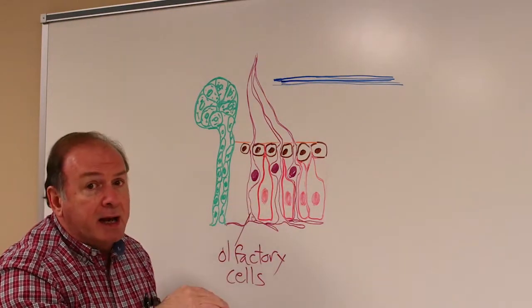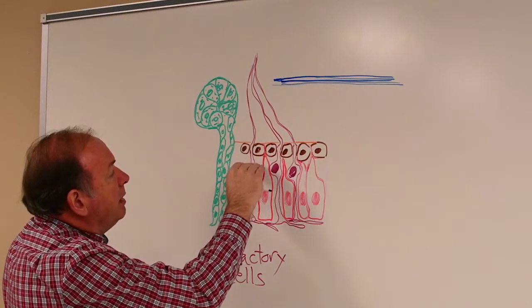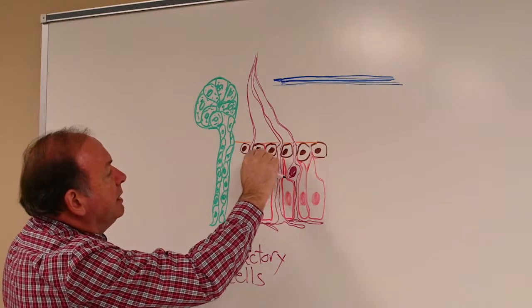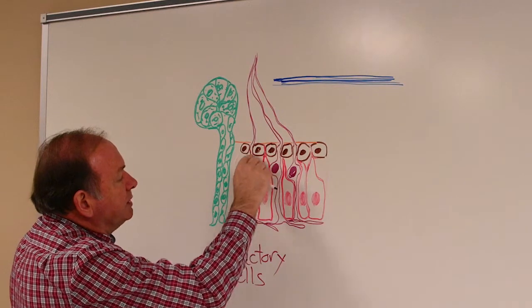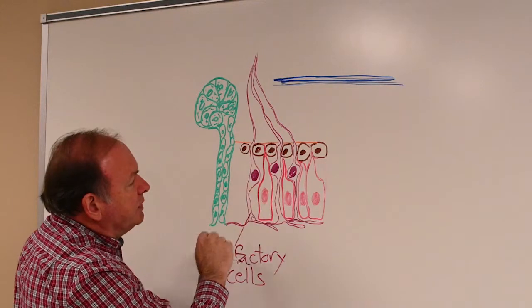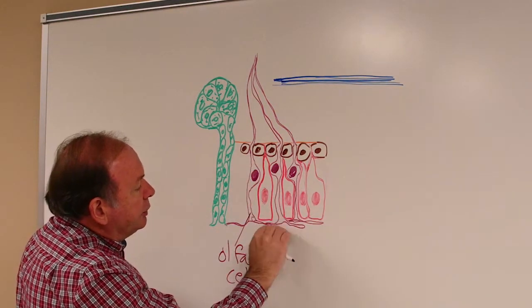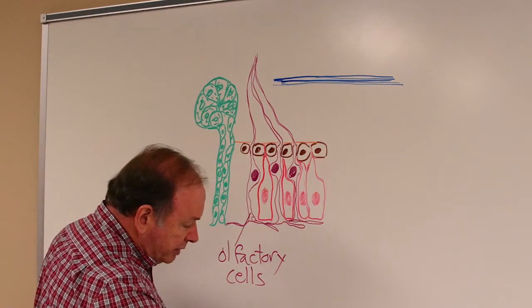When you're trying to recognize them in olfactory tissue, their nucleus will lie above or past the row of basal cells we have in brown here. This series across here are basal cells. Next nuclei out would be olfactory cells. And then the third cell type of the olfactory epithelium is the supporting cell or sustentacular cell in red here. And their nuclei generally lie closer to the surface, out beyond the nuclei of the olfactory cells.